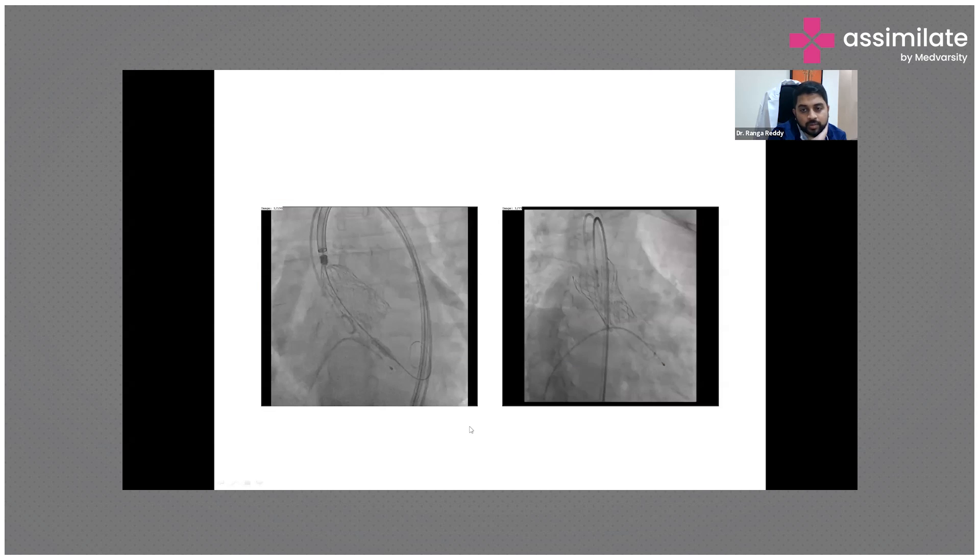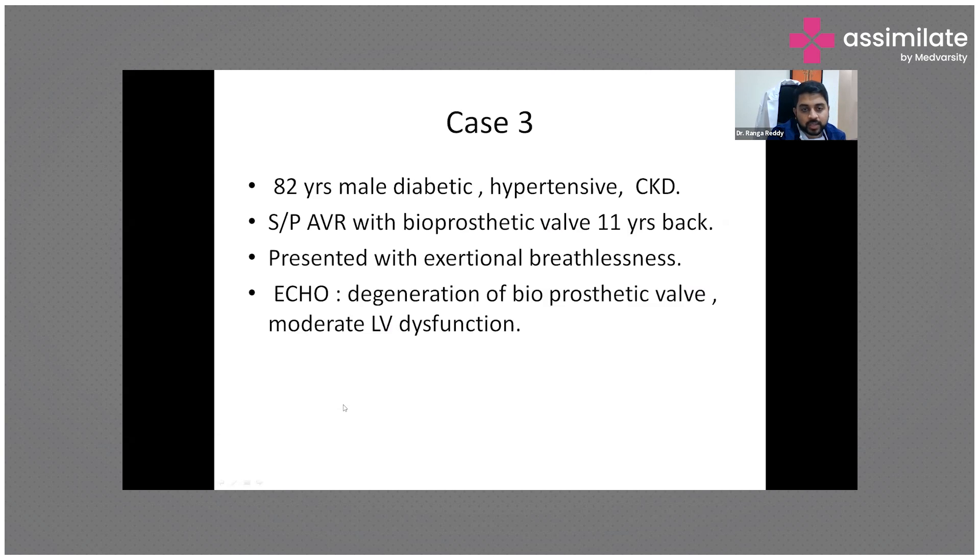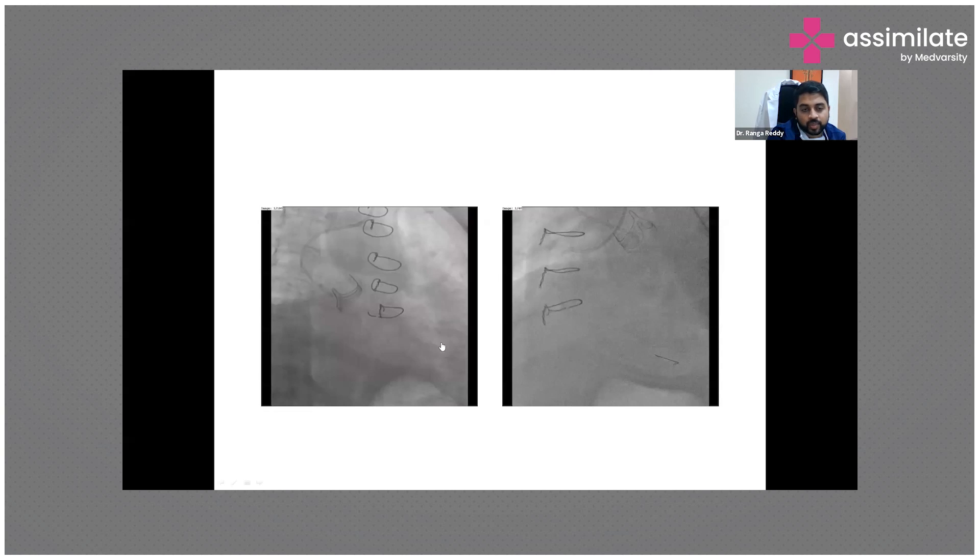This is the self-expandable valve. On the left side you can see the point after which we can no longer recapture the valve. After deploying, this is how it looks. Once all pressures and aortic gradients are confirmed to be fine, we remove all the pigtails and wires, and this is the final placement.